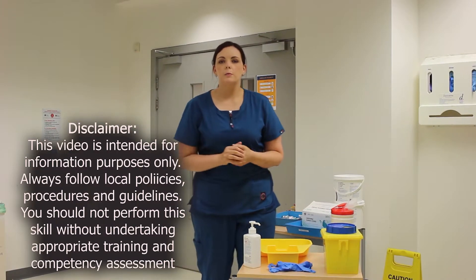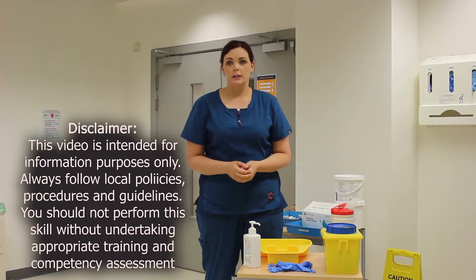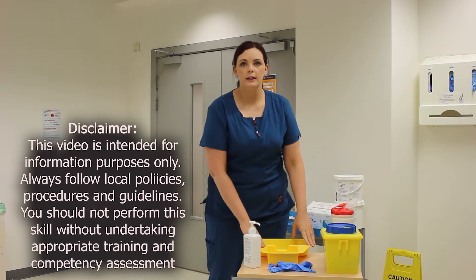Hi, we are the registered nurse tutors. I am Liz and my name is Siobhan. Today we're going to cover the skill of venipuncture. Before starting the procedure, I need to make sure I've got clean hands, clean equipment, and a clean environment.